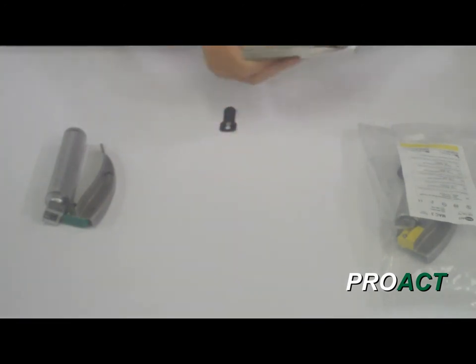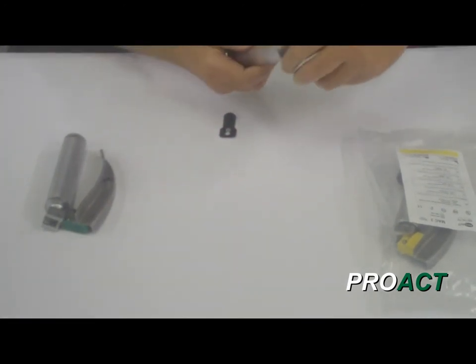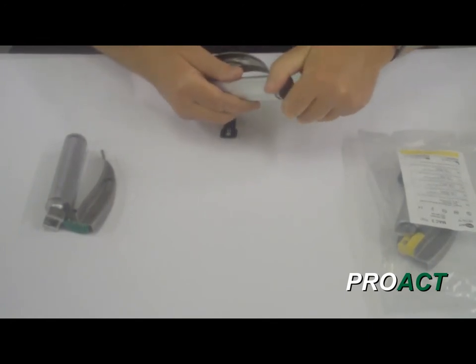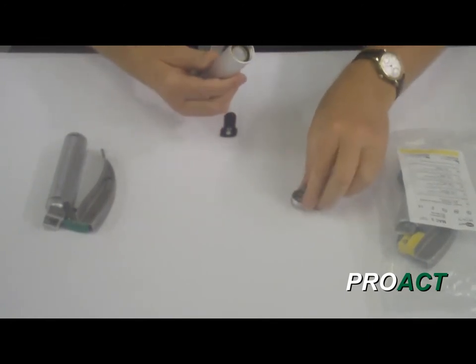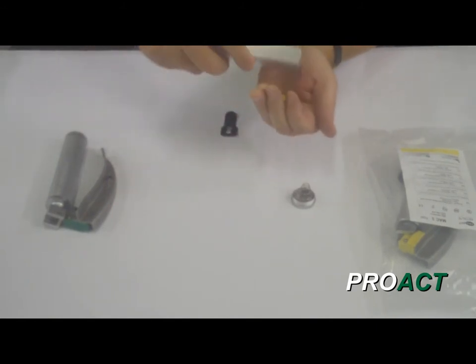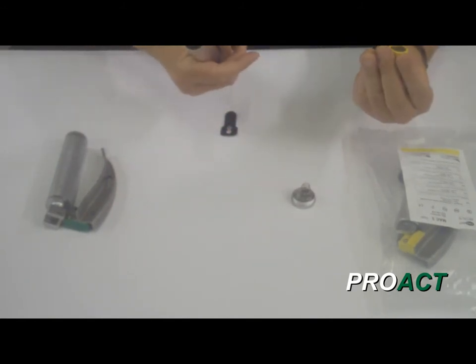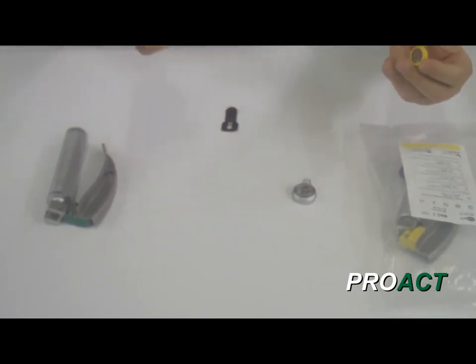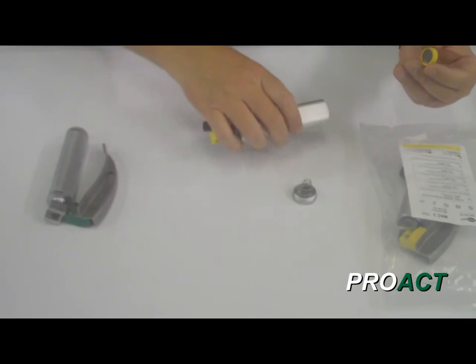Some people would ask, how do you then remove the batteries for recycling? And it's quite simple. You remove the base and the batteries drop out as one piece at the bottom. That can then go off for recycling. The rest of the blade can go off for recycling. Okay.